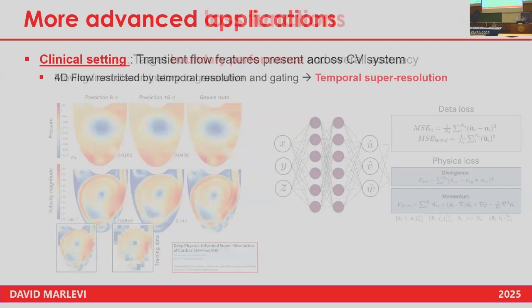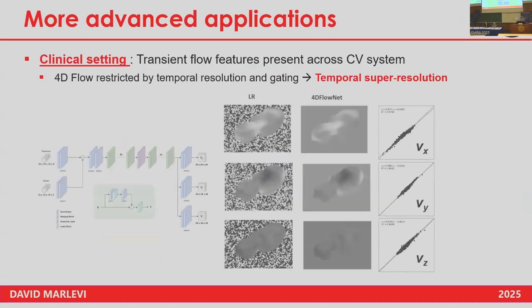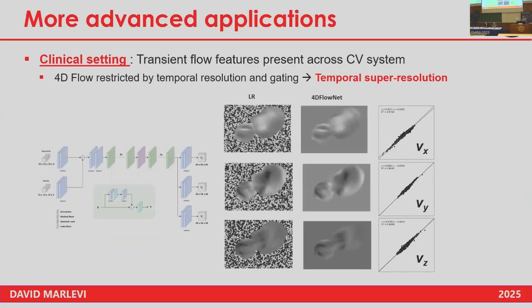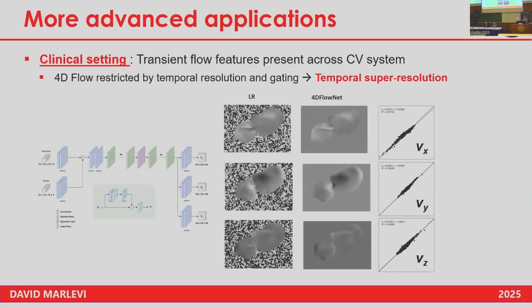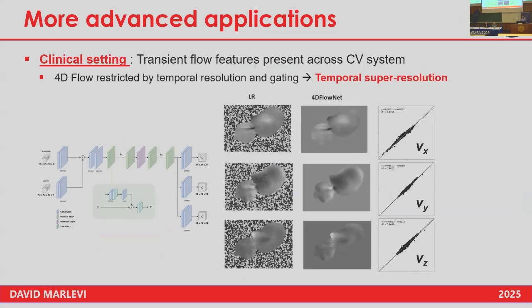A few other examples before I wrap up about applications. This is now from the group that I'm leading in Stockholm, but also other groups around the community, looking at applications, not just in space. Pia Kalmer, again looking at temporal super resolution, so using the same network, but rather than converting in space, you convert in time, looking fairly well on simulated data.